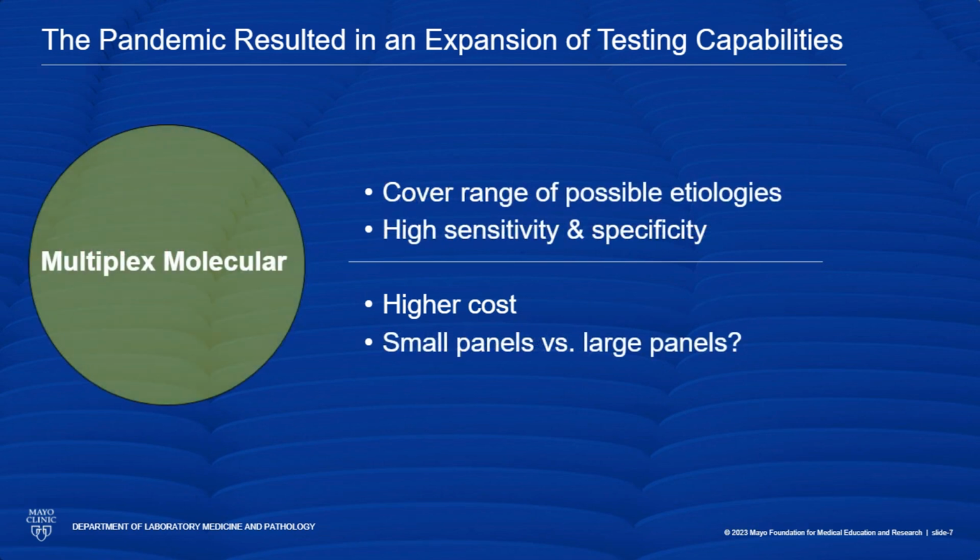And then finally, multiplex molecular tests. These obviously cover a range of possible etiologies, so they're very beneficial when we don't know what might be causing the infection.